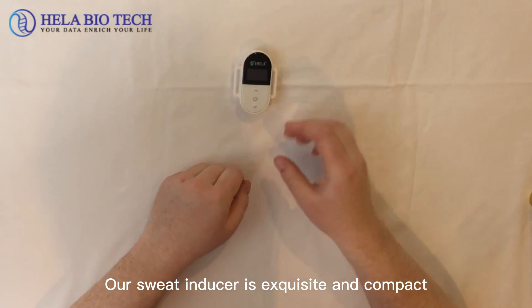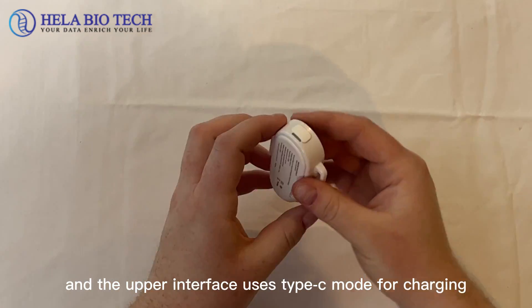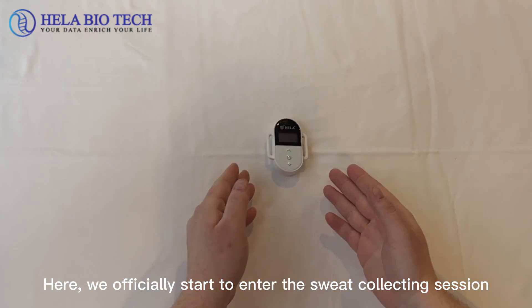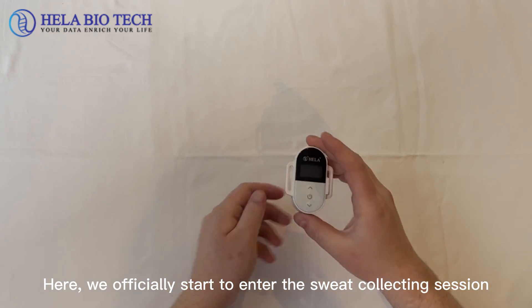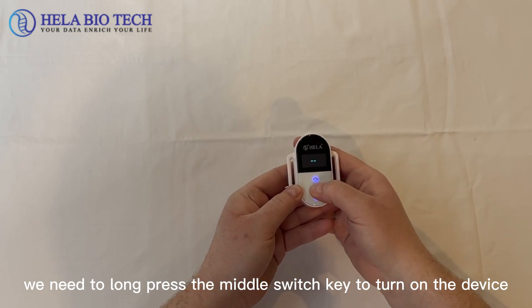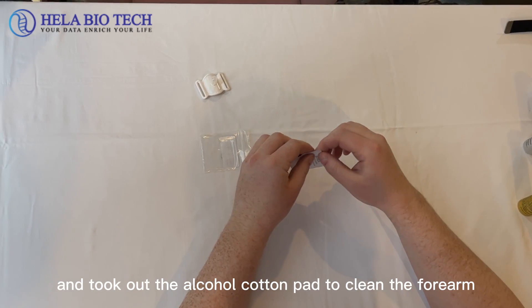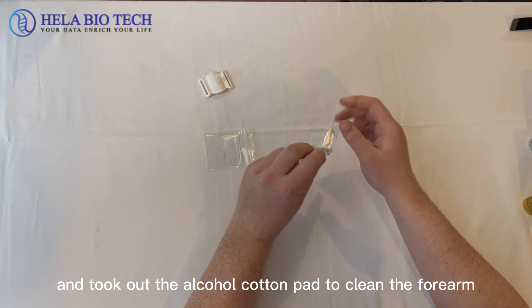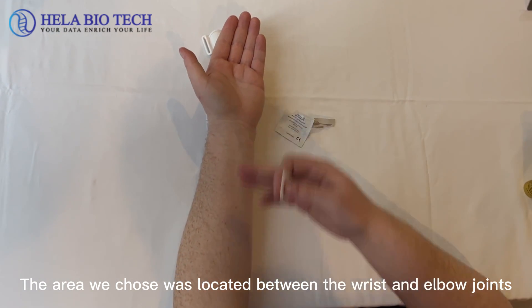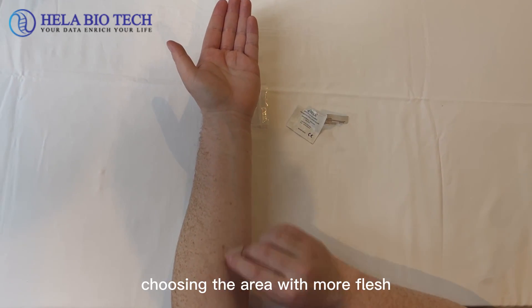Our sweat inducer is exquisite and compact, designed to be wearable, and the upper interface uses a Type-C mode for charging. We officially start the sweat collecting session. We need to long press the middle switch to turn on the device. First, we unpack the kit and take out the alcohol cotton pad to clean the forearm. The area we choose is located between the wrist and elbow joints, choosing the area with the most flesh.